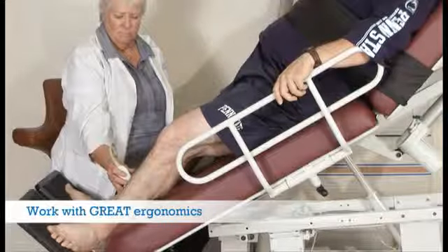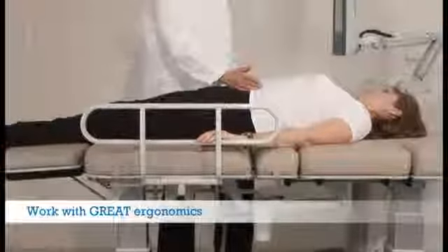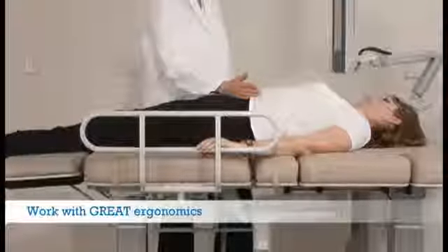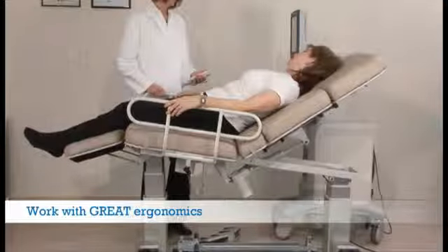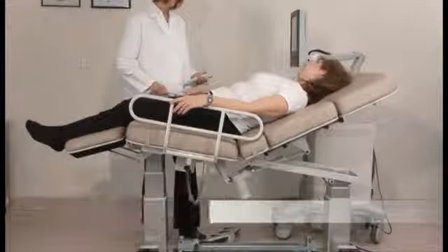Our unique vascular table allows reflux studies to be done safely. On-demand height changes and tilting functions, along with a two or three section top, allow you to create the same comfort as a zero gravity chair for your patients.